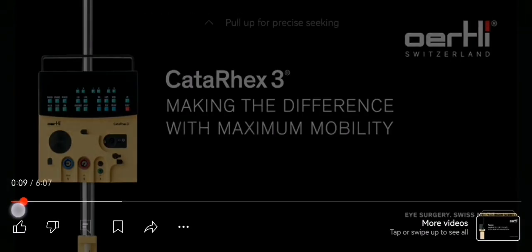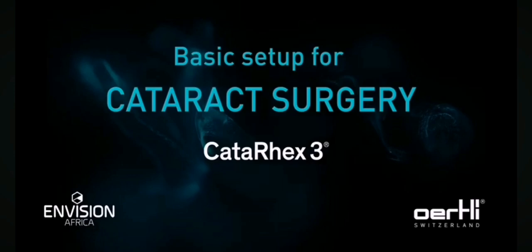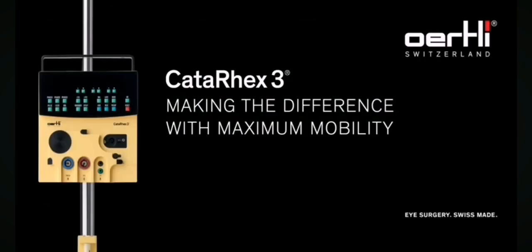Welcome to our Cataracts 3 training video. With this video, we will teach you how to complete a basic setup for cataract surgery using the Eartley Cataracts 3.